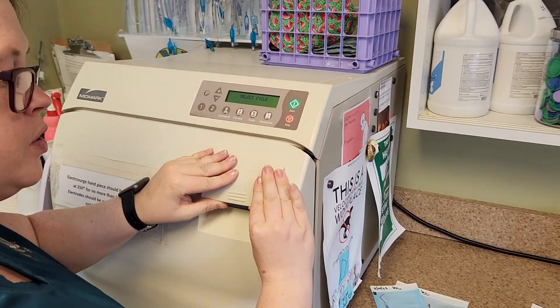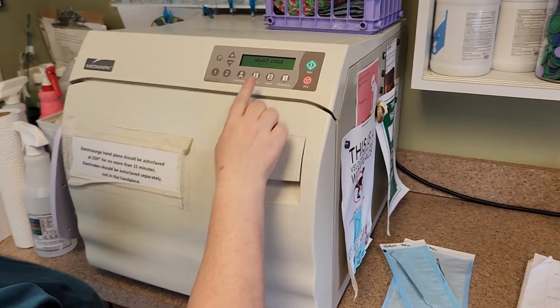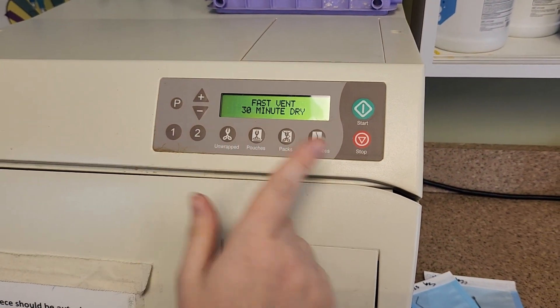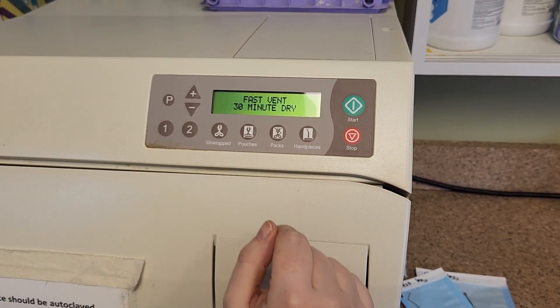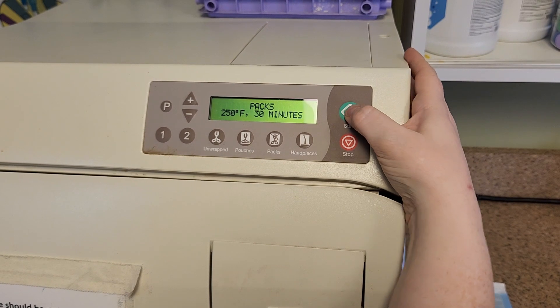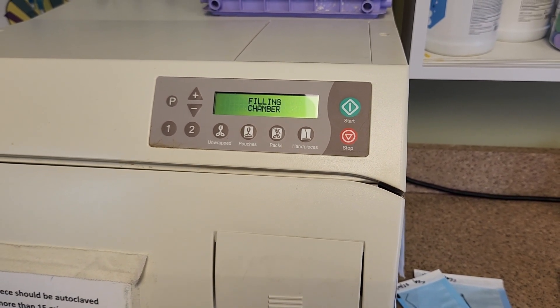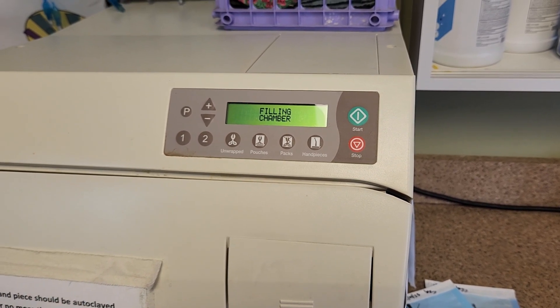Pull up on the handle to push it all in, and down to secure it. These are packs, so I'm going to select the pack setting. It will tell you the temperature and the time, and then there's a fast vent for drying. Then you can just push to start. You can generally hear it making noise as it's taking water into the main area out of the tank.